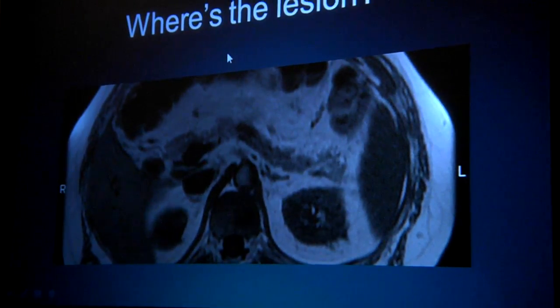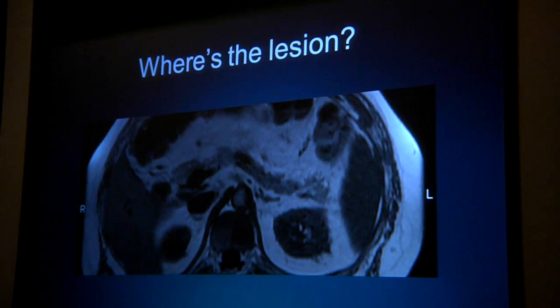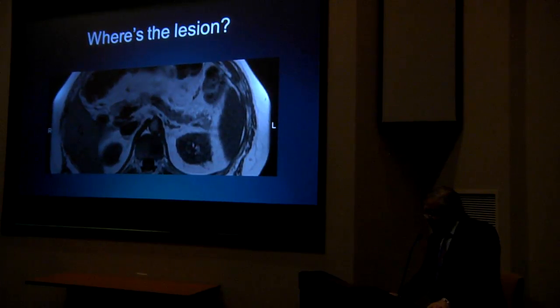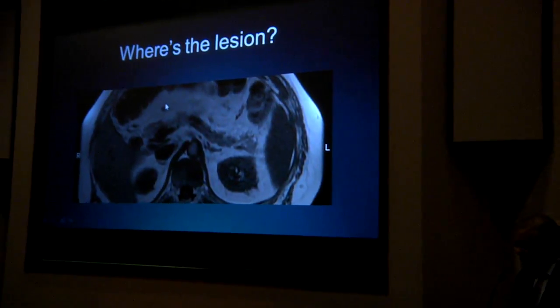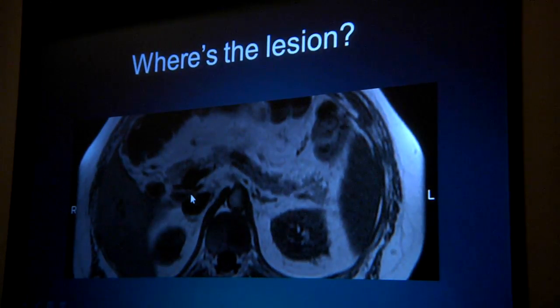In the setting of HIPEC, we rely predominantly on the diffusion-weighted scans where the bad stuff is bright because it increases lesion conspicuity, and I think we've probably had in some of our patients our greatest success in looking in the postoperative setting for patients who may have residual small areas of disease when CT is not helpful. On a good day, this is an ordinary proton density or T1 weighted image, you may, if you're really awake and alert, understand that this is actually a real lesion in a patient with metastatic colon cancer who had undergone HIPEC.